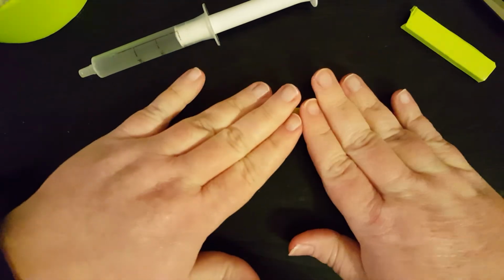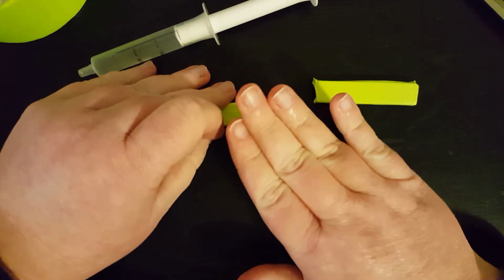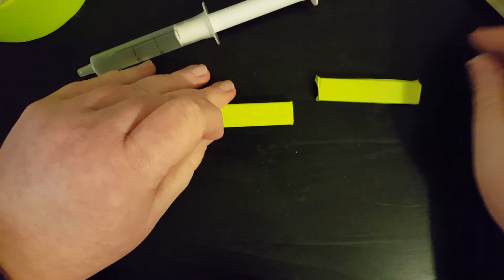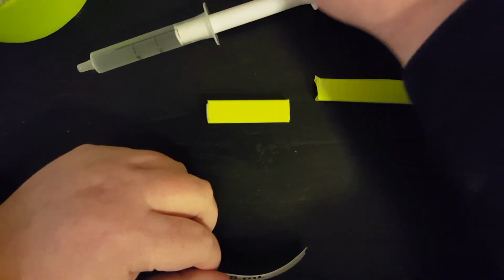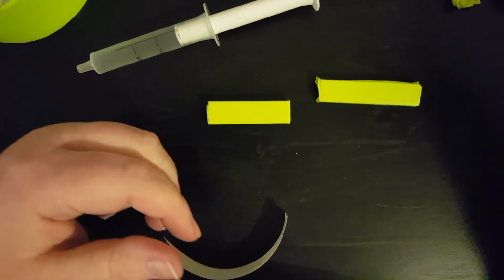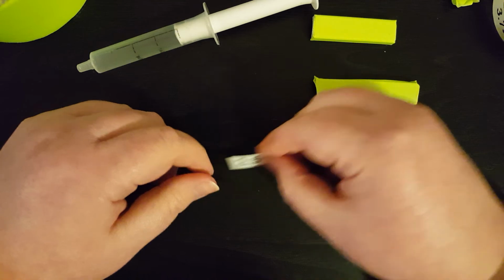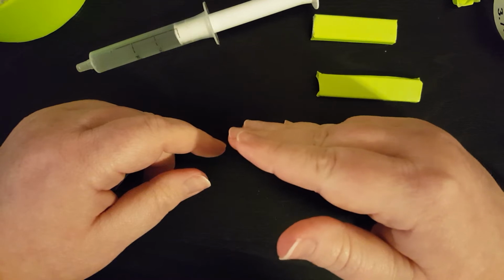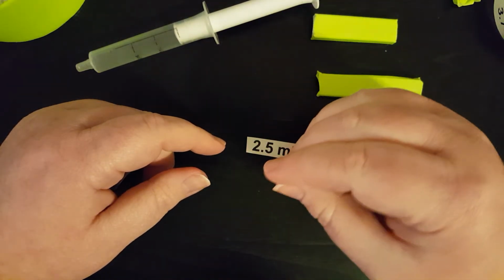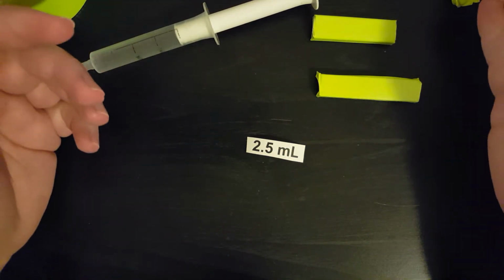Now, I have, like I said, one that I've done previously, and then we have our current one. The one I've done previously was our 2.5. Now, for this video, I did large print labels on a Dymo labeler. There's a lot of different label options out there, especially with large prints, because they can adjust the font size, and you can get some at Best Buy and Office Depot, things like that. I saw one at Best Buy for less than $30 recently. But a Dymo labeler works really well too.